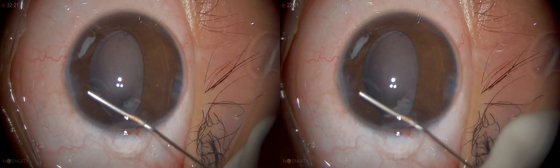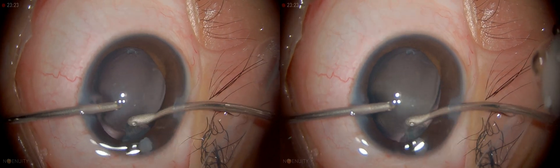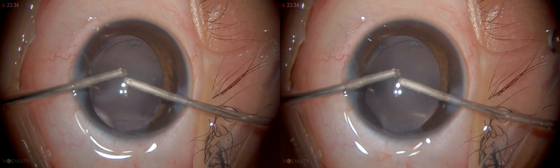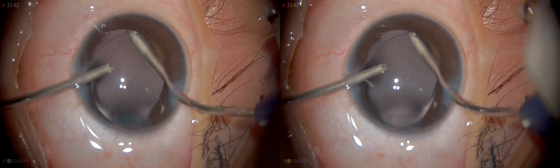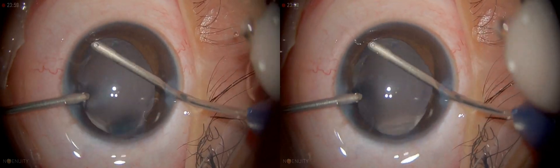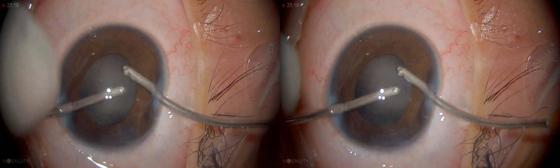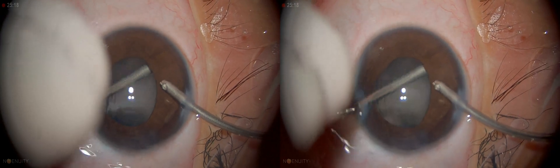Sometimes this cortical matter can go in like that — can you see a strand there? I'm going back to the bimanual now. There is some cortical matter left at 12 o'clock and some little bit firm cortical matter inferiorly — both of which I'm going to take out now. This is a little bit thick part here sometimes. I try to remove the cells as much as possible. Just under the surface of the anterior capsule, remove as much visible lens epithelial cells as possible. In a child you try to give whatever is best possible on the table.